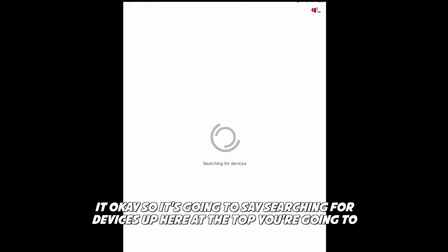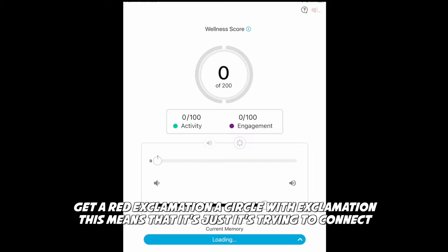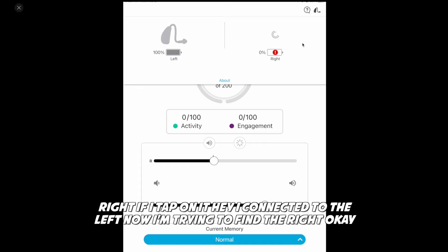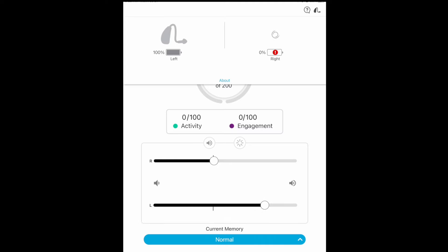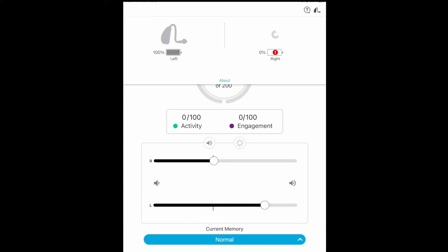It's going to say Searching for Devices up at the top. You're going to get a red exclamation circle — this means it's just trying to connect. If I tap on it: I'm connected to the left, now I'm trying to find the right. And then eventually it will connect to both and that indicator will go away.